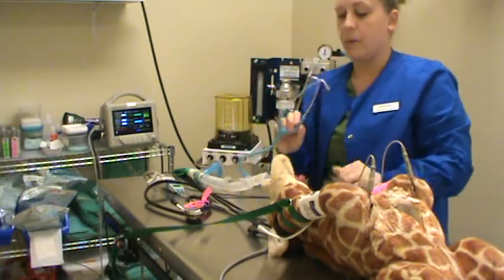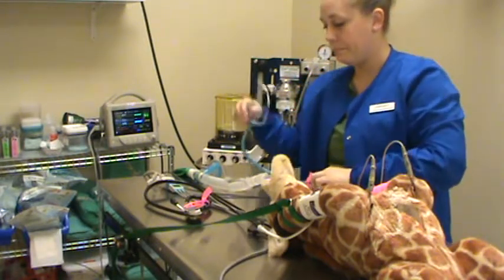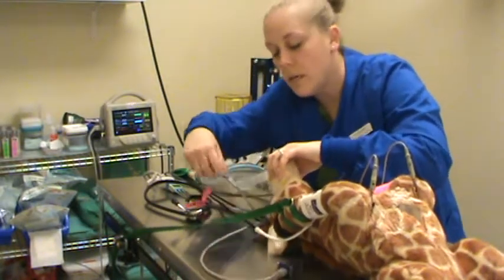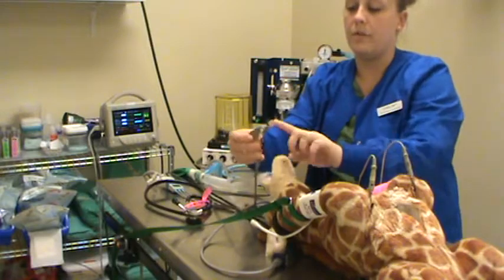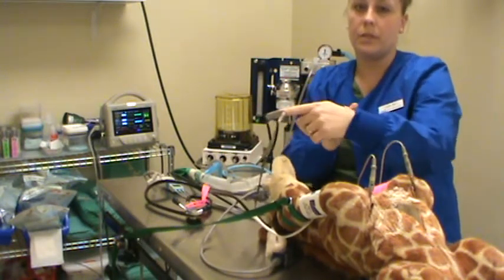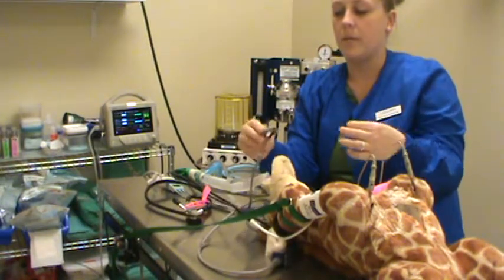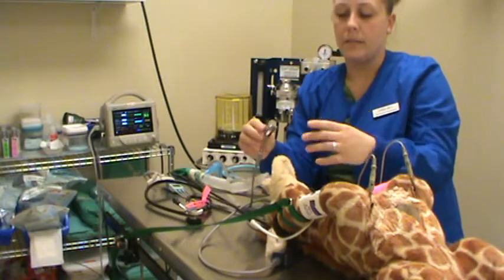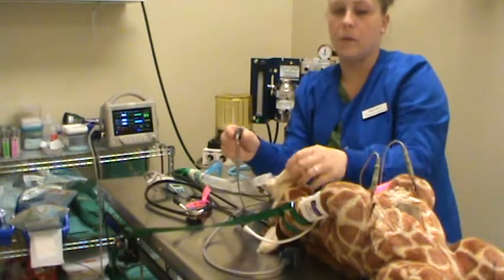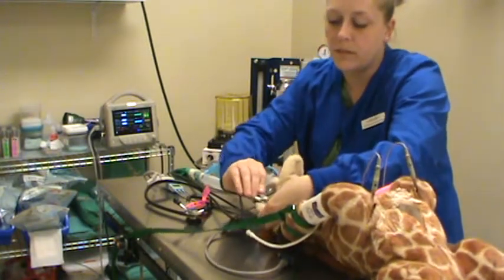You can hear a really, really strong, really good heart rate through these because it's sitting right next to the heart. So the last piece we're going to hook up here, second to last piece, is our pulse oximetry. So we have a little pulse ox here, just like a human one, but this is a clamp, so you can put it on a tongue, you can put it on a prepuce, you can put it on the ear, a toe, sometimes people even use a vulva. It depends. It just has to be a really light colored piece of skin or the tongue. So we're going to go ahead and put it on the ear here since this patient doesn't have a tongue.